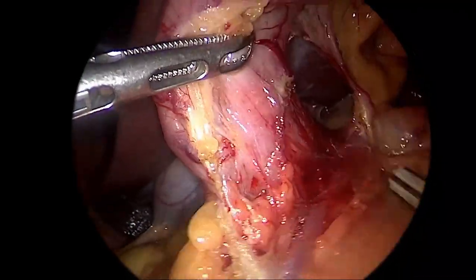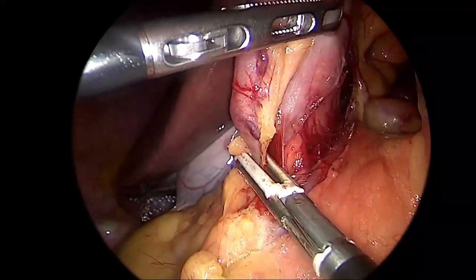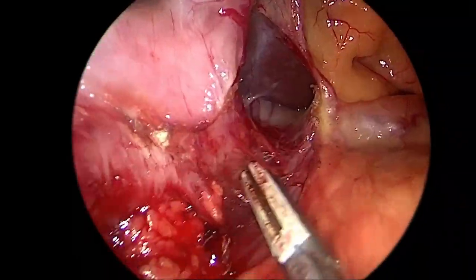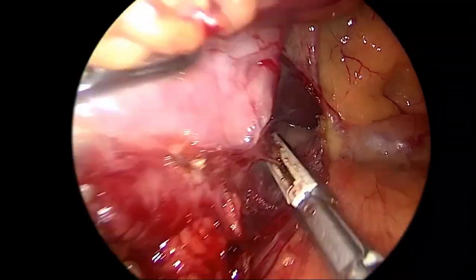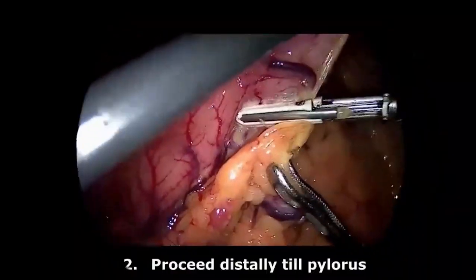I go close to the duodenum, or what we call hug the duodenum. Now I can do some dissection of the small vascular branches between the gastroduodenal artery and the duodenum. All these steps aim to have more length. Now, as you see, I have gained more length of the duodenum.